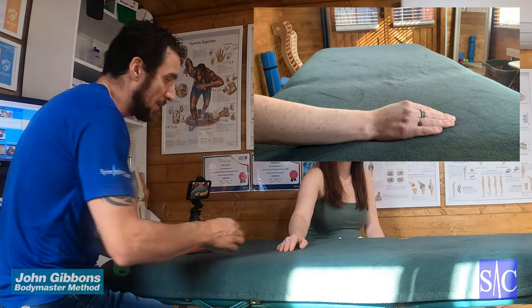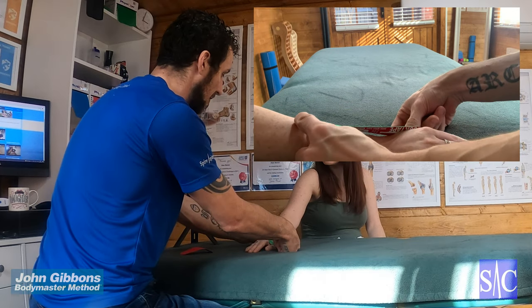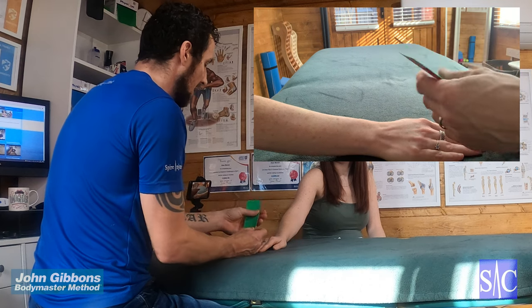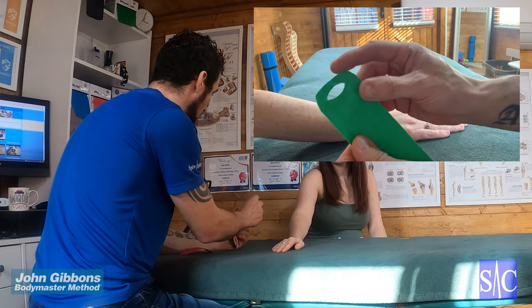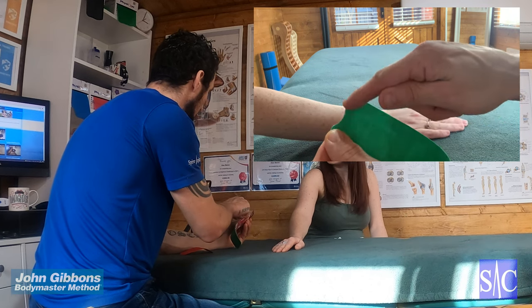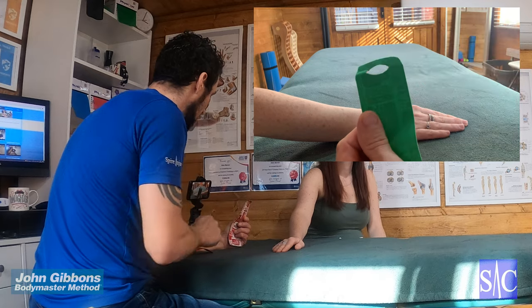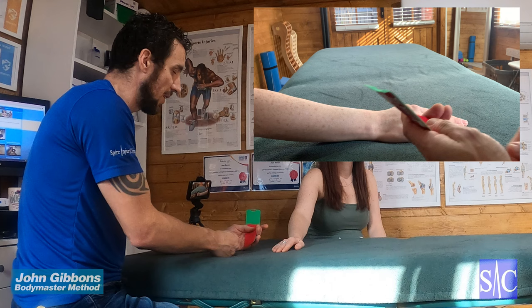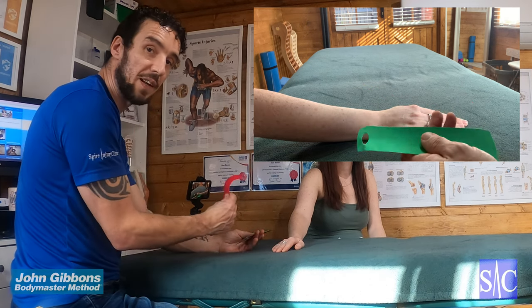What we need is two strips of tape. I just measure from the base of the thumb to just over halfway up the forearm — that's my first piece. I then rounded off the edges, and at one end I've folded it over, cut a little semi-circle, which gives me a hole at the end of the tape. The second piece I measure just over half the size of the first piece, again with rounded ends.